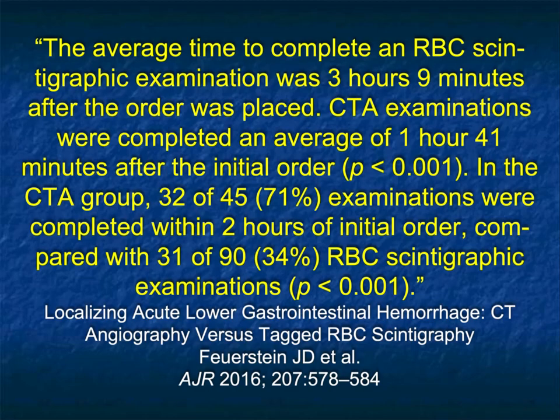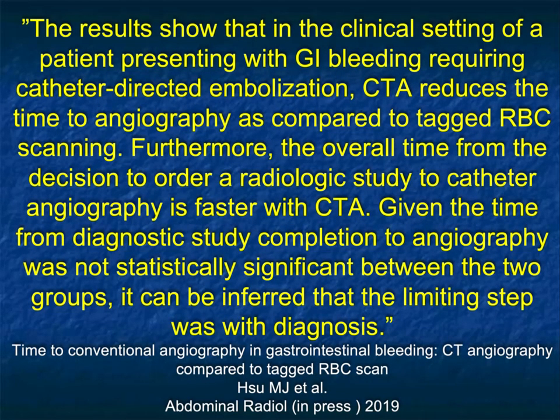The article also made the point the average time to complete a nuke study was over 3 hours after the order was placed. CT was about half that. And if you're really efficient, you can make CT even faster than that. So again, time is always of the essence, particularly when it's late at night, which seems to be the time for all bleeding studies.